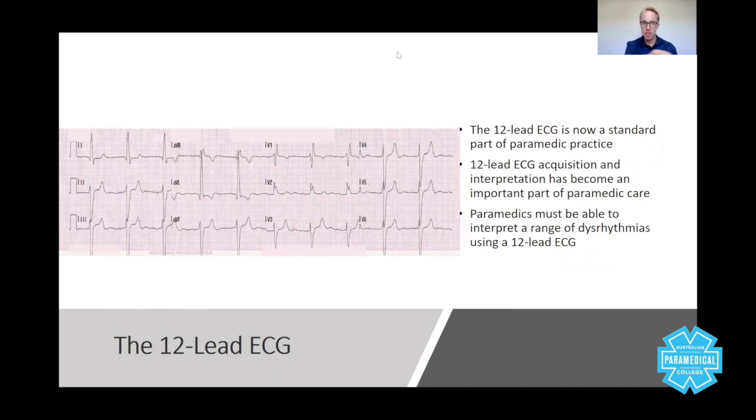Now let's try and remind you guys what a 12-lead is. Imagine this image here is a picture, lots of different pictures of the heart. So imagine if you take a camera and you take a picture this way and you press the button. Then you move it and you look this way and you press the button, and you move it this way and you press the button. That's exactly what a 12-lead ECG is. It's lots of different views of the heart.